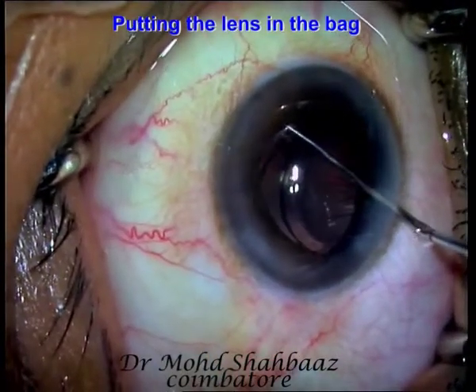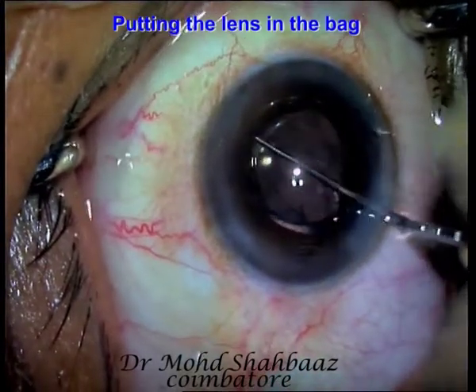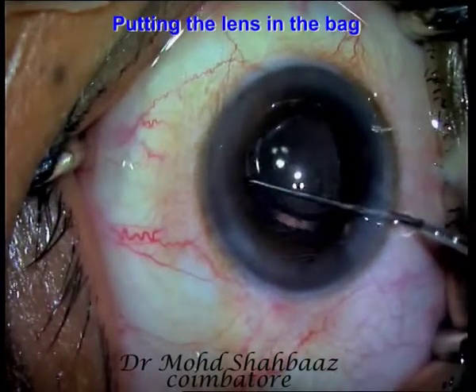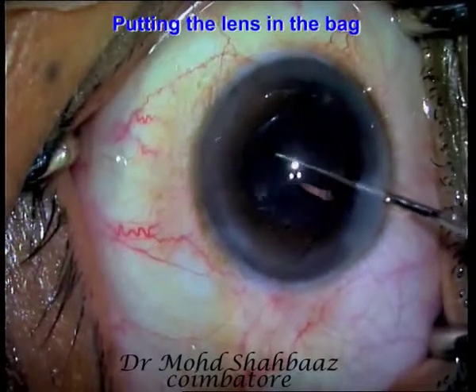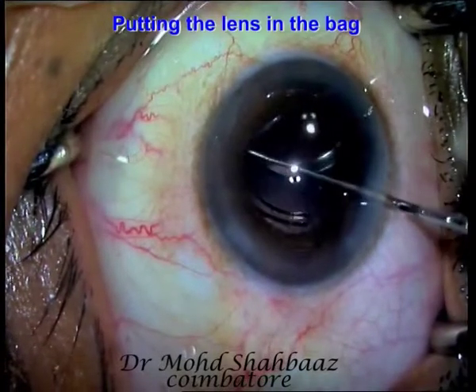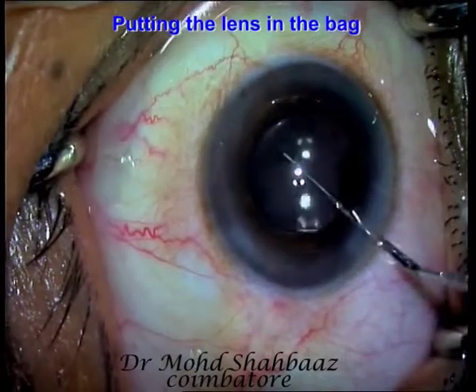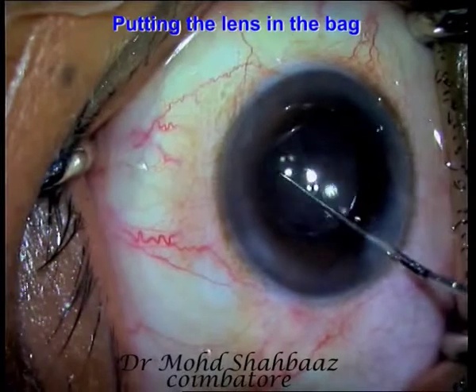just checking for the stability of the first haptic. Now the haptic is in. I am dialing it to bring the other haptic this side. Now just putting the other haptic also inside the bag. Now both the haptics are inside the bag and the lens is well centered.